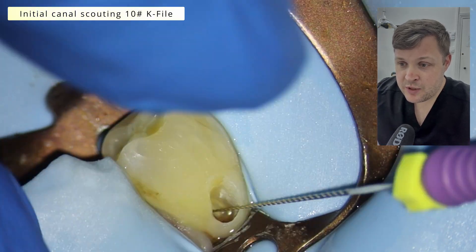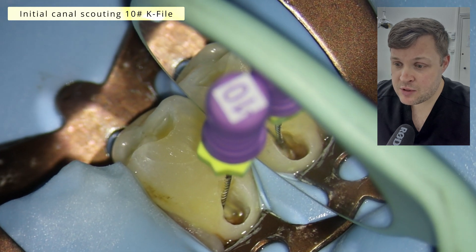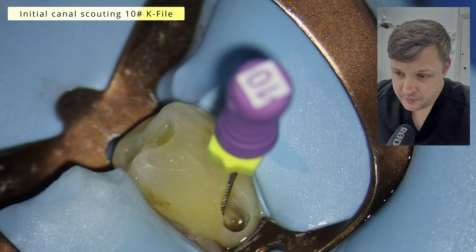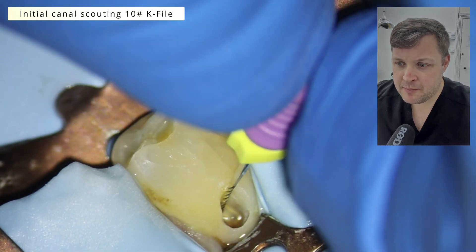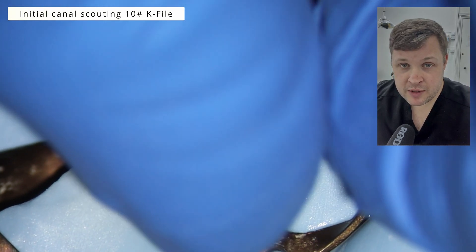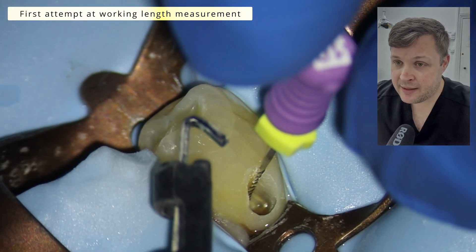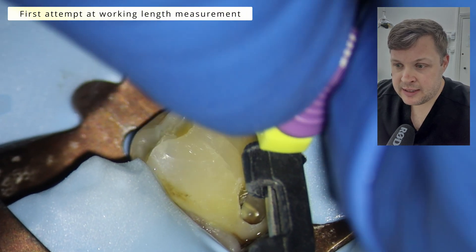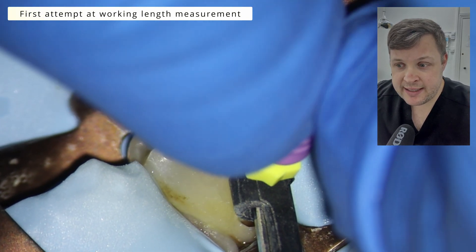As with all cases, I am using a size 10 K-file to scout the initial part of the canal. As you can see, it is kind of at a 45-degree angle, so I'm going to be really super careful about torsional fracture. I'm very gently watch-winding my hand file to shape the crown to mid third. I felt like the file was actually reaching down the tooth quite easily.